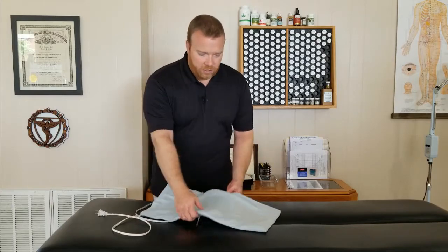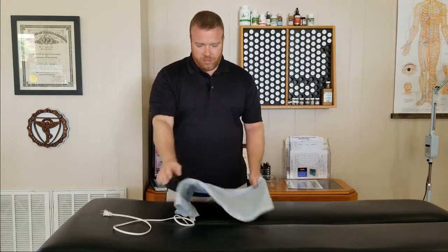Once that hour and a half is over, take your heating pad — everything's nice and hot — put it back over that spot for another twenty to thirty minutes. You can do this as many times as you want throughout the day. I suggest trying to get in at least three times. That seems to be the magic number where things really, really improve.